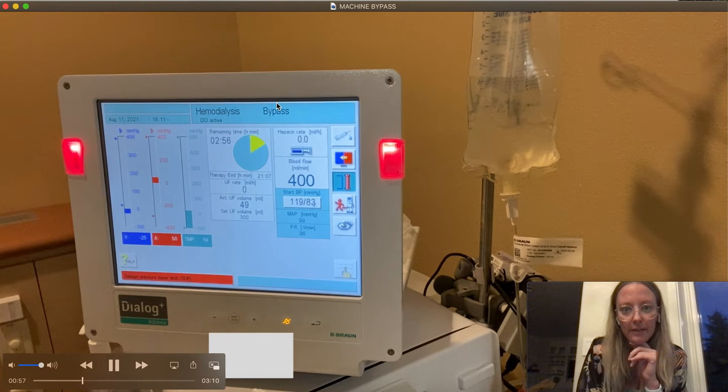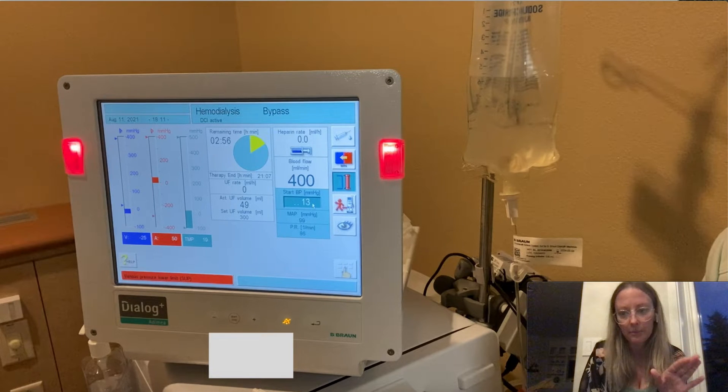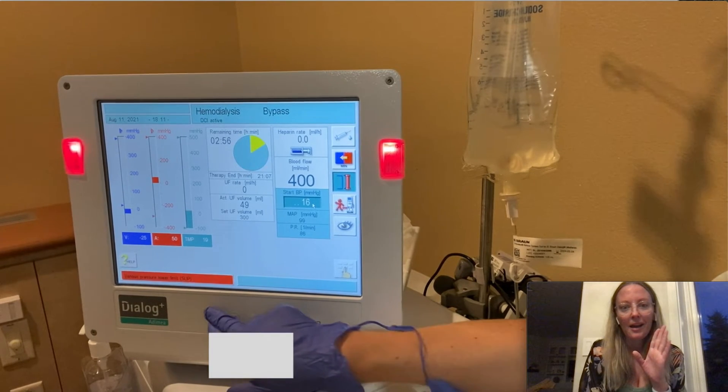I'm going to rinse back their blood. Once their blood is rinsed back, I have them in a sitting position and I am going to get a blood pressure before I move them out of the chair. I get a good blood pressure.